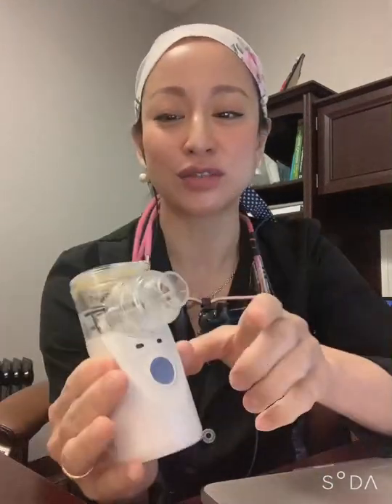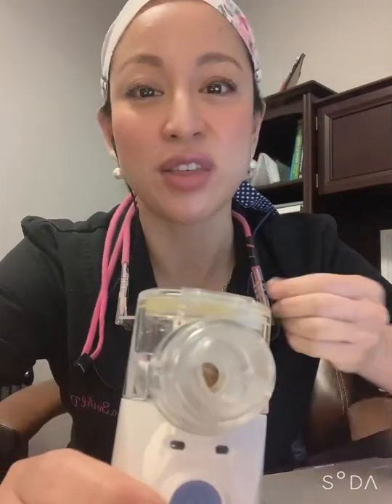With my first handheld nebulizer, I tried to clean the mesh forcibly. I have made every mistake possible with these little mesh nebulizers, so I hope you can learn from my mistakes. First of all, don't stick anything on the mesh. Don't touch it. It's a thin membrane, very delicate. And the second thing is, don't nebulize with any liquids that are thick.